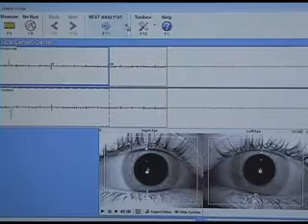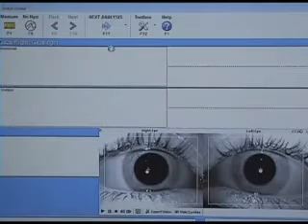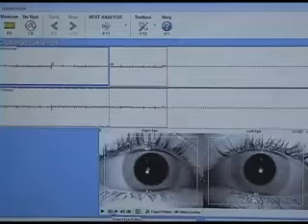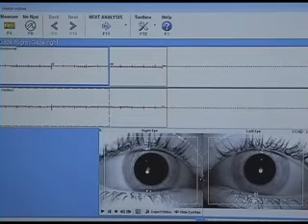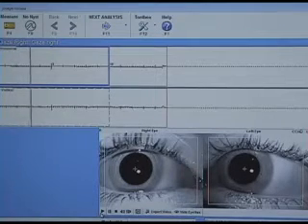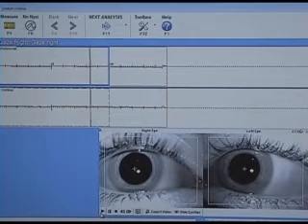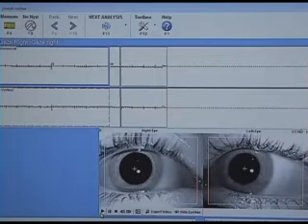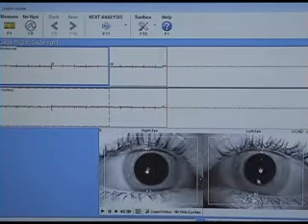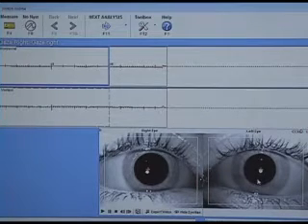If we look at somebody's gaze, we test them to the center, to the right. Here's the right function, and we can see a nice printout, a very nice straight line. If we look here, he moves his eyes to the right. There is no movement, and this was a normal subject without any neurodegenerative aspects going on, or head injury or anything of that nature. We can also look at the size of the pupils. They should be even from side to side. And these are some of the things that we can look at with gaze.